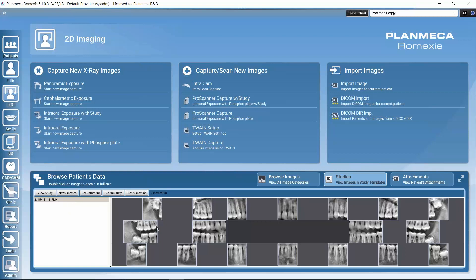Now that I clicked on this row, we see that all the images in the study got a light border around them — that means they are selected and active. If I click on 'View Selected', we'd be able to view all of these images. If I would only like to view a sub-selection, I could click on individual images to deactivate them and define which images would be viewed.